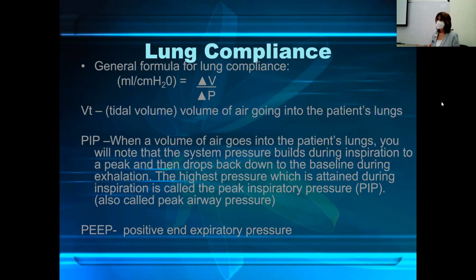All right, so peak inspiratory pressure, PIP. You can never say that as a word. You always have to say the 3 letters. You never call it a word because it gets confusing. A lot of people look at that and they say, oh, that's PEEP. No, it's not. PEEP is PEEP.